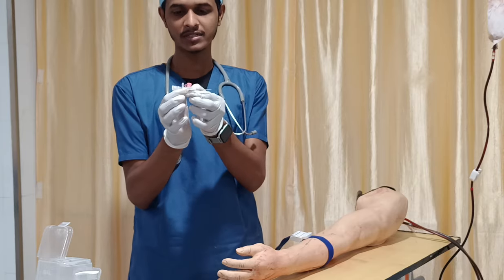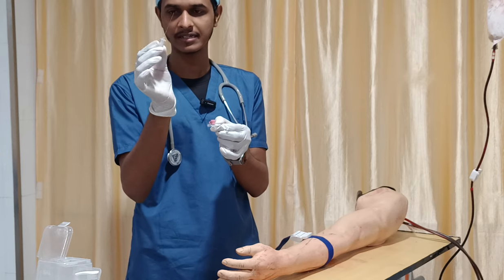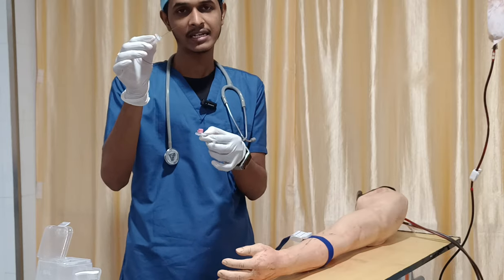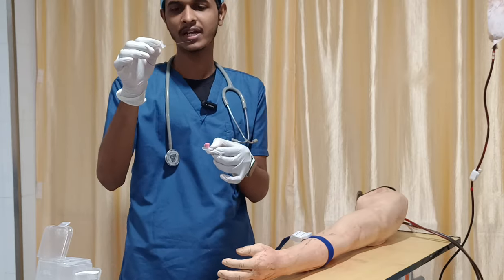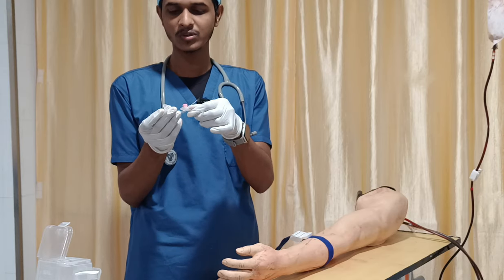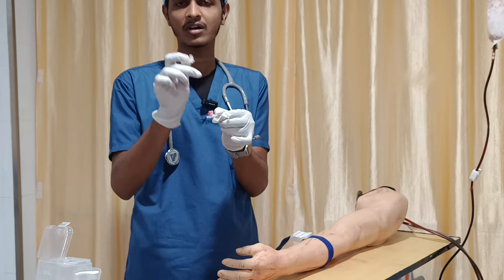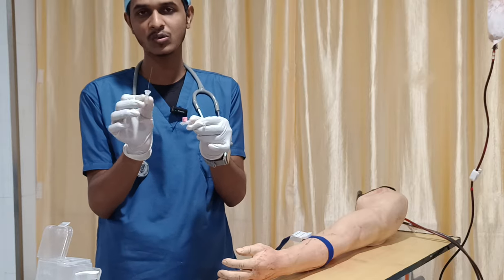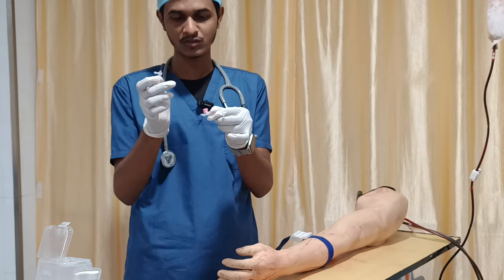Two portions are there. One portion is the stylet-like portion, or this needle is a securing needle, or holding needle, or introducer, whichever way you can call it. And then we have this portion called the hub, and the hub is attached to your plastic portion. All these things are sterile, so you have to handle them in a very sterile manner. Aseptic precautions should be taken.